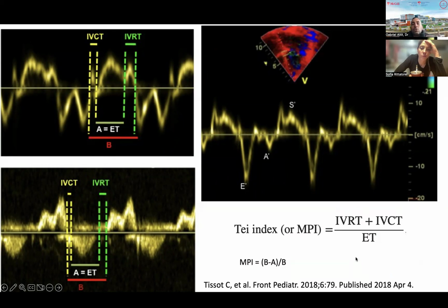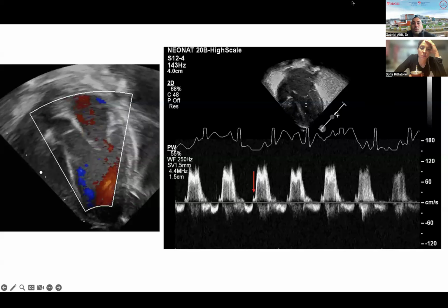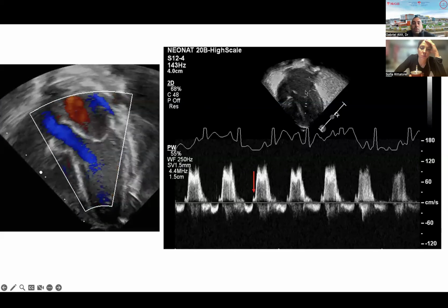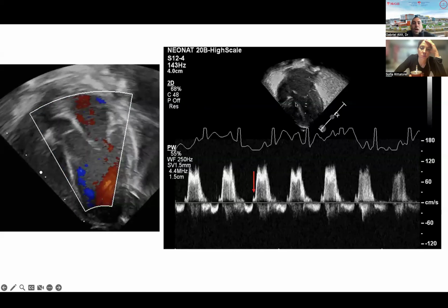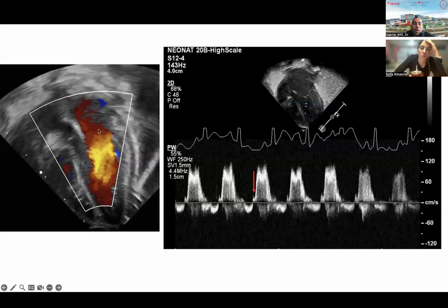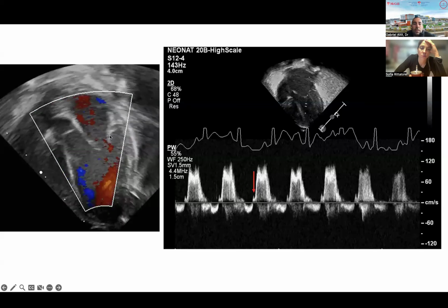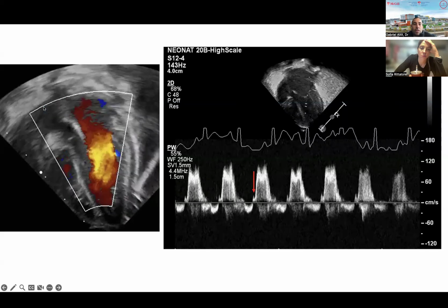And there's a lot more research going on with TDIs to try to see if you have early predictors of adverse outcomes. So you can do this also using what we call the pulse wave Doppler. The pulse wave Doppler is actually the inflow-outflow velocity in the 5-chamber view. You go at the intersection between the red and the blue, red being the filling of your LV, and you can see that swirling and going towards the LV cavity, the LV outflow tract, eventually into the aorta.